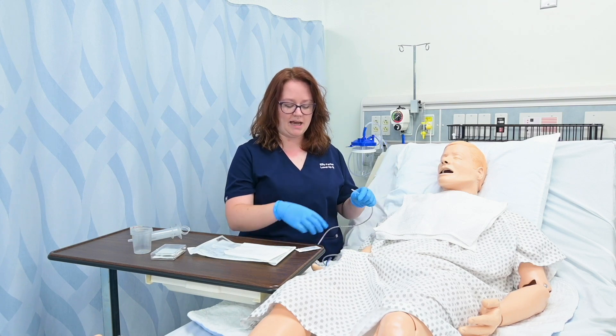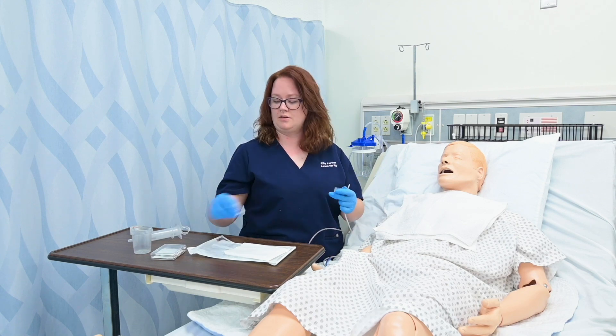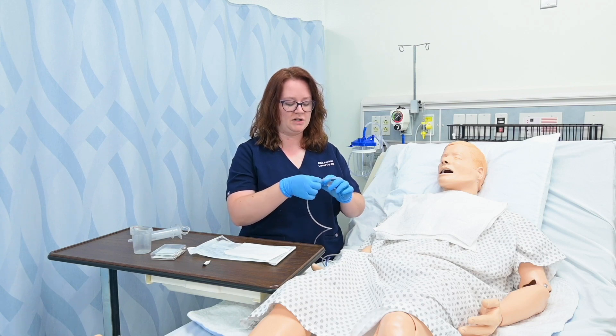Once I note that measurement, I'm going to lubricate the tube to facilitate the insertion. So I'm going to open my lubricant and generously apply some lubrication to the tube.